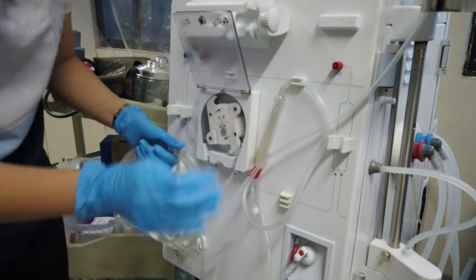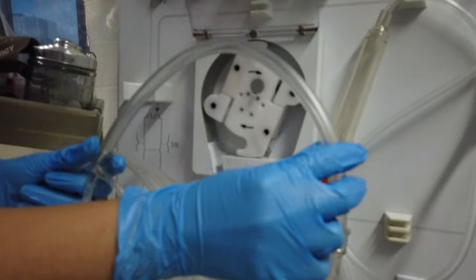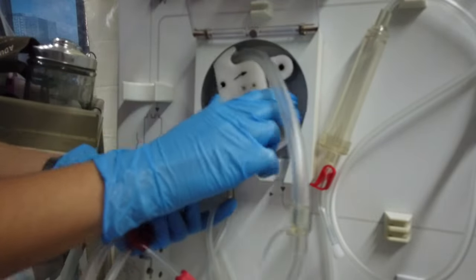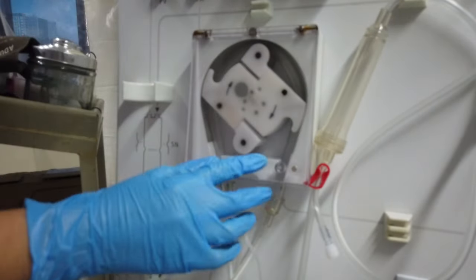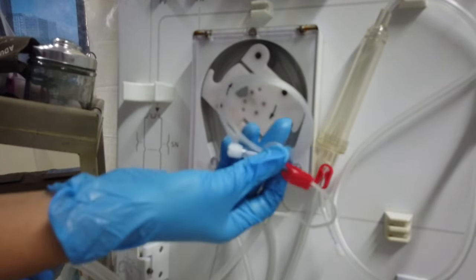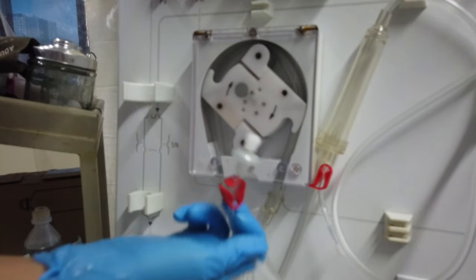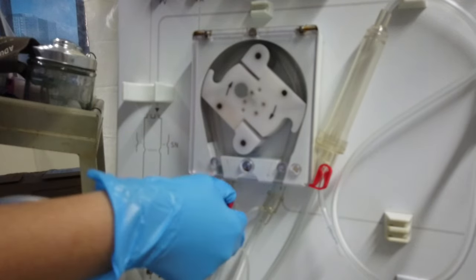Open the blood pump cover, insert the blood pump segment into the blood pump housing. Tip: attach the left end before the hook-like feature of the pump. Turn it clockwise and see how the segment easily glides into the housing. Then close the cover. You will know if your segment is properly placed if your right end is your heparin infusion line, while your left end is your arterial transducer line. Then close the clamps of both the transducer line and the heparin infusion line.